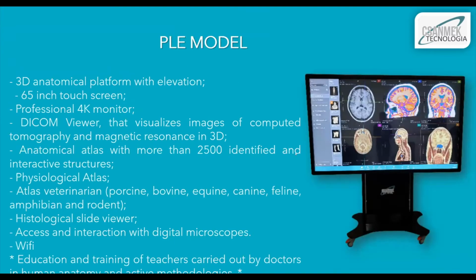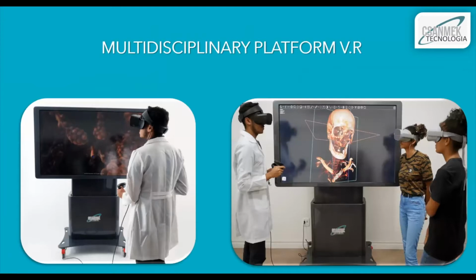So the intention of showing you these models is that we have more economical versions of our prime solution that have differences in the engine of the adjustments of the screen, but the resources are going to be the same. So those are the three main models we work with. And we plan to show this today as well.